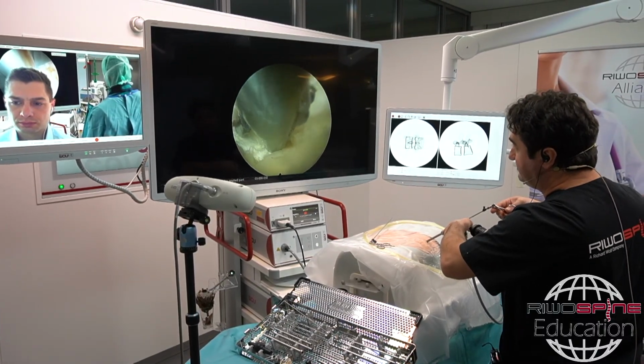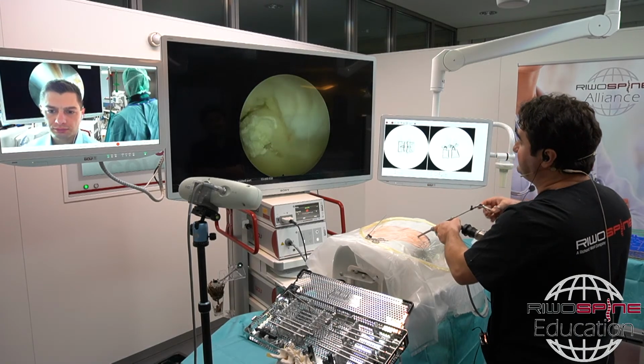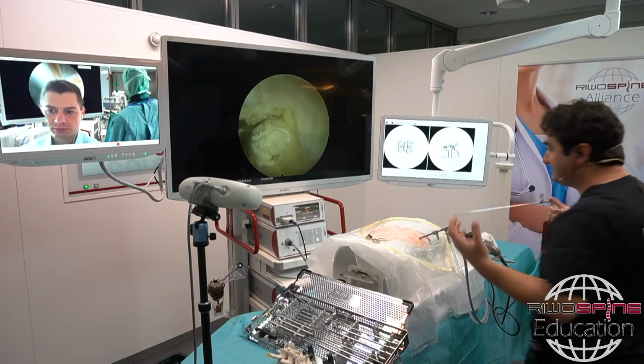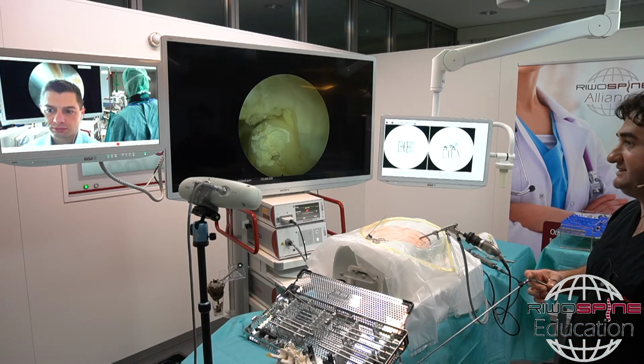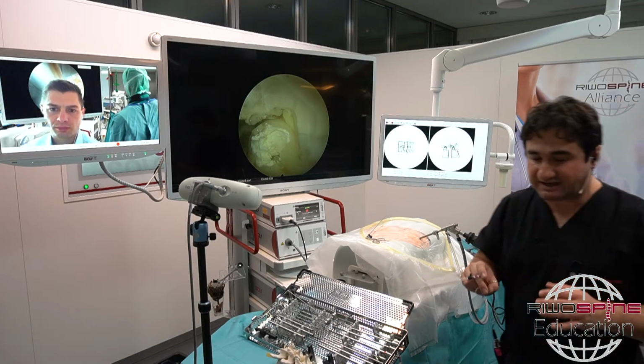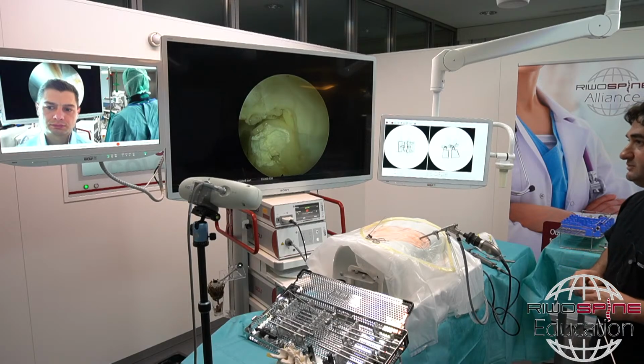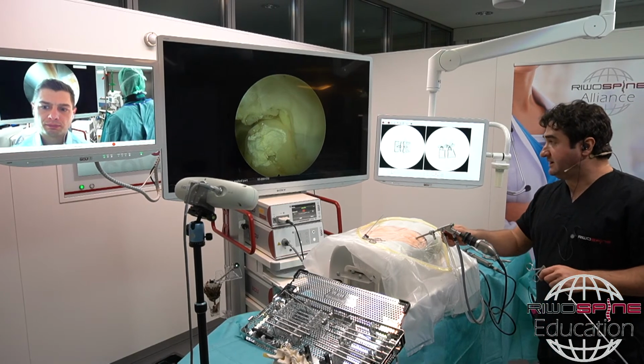Of course, it is possible if you are sure that you are not grabbing something, then you can use this one. Usually, we use the larger instruments inside of this space to clean more nucleus material. But around the neural structures, my recommendation is always to use the smaller instruments to see what you do. Okay, thank you.